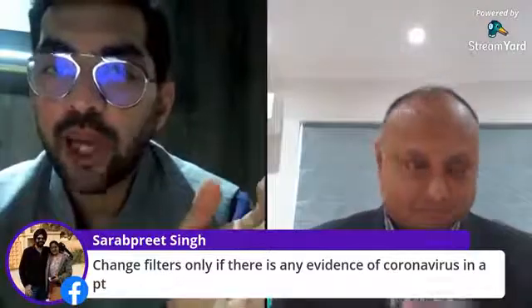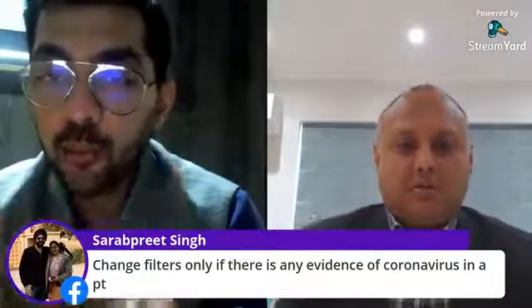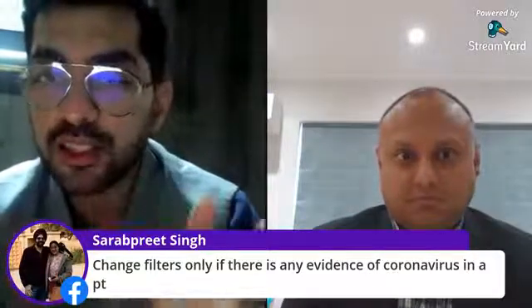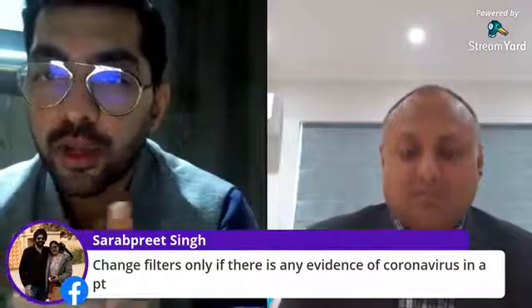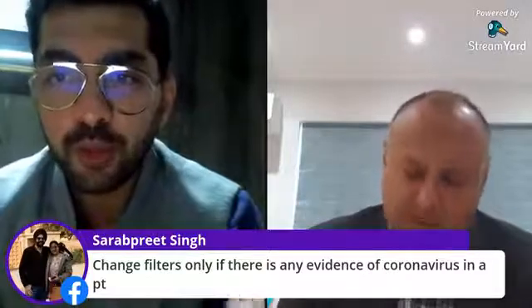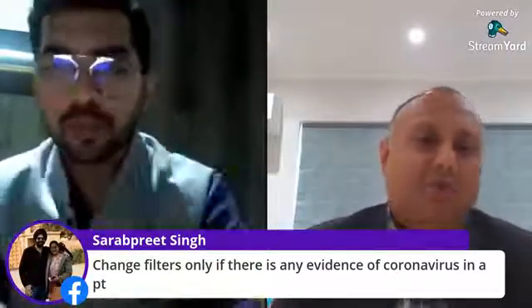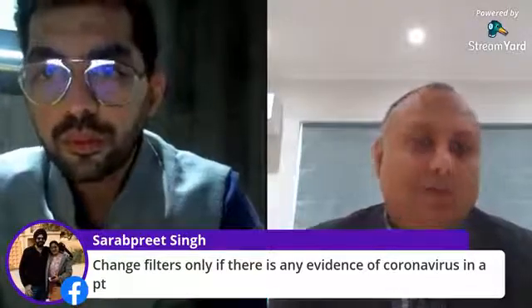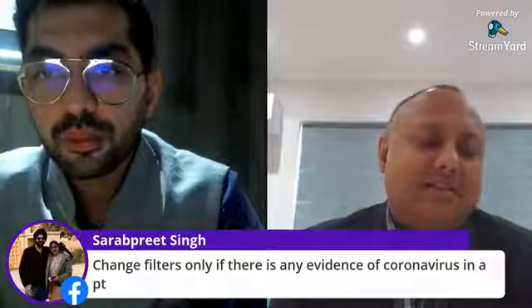I'll go back to a very basic question, Alpesh. How much time before should one actually start doing all of these activities before starting a laboratory? So, basically, it's advised about 2 weeks or something. Should it be more than that? No, I think two weeks is plenty. I think the moment you see your first patient in clinic, or when you start your stimulation, that would be the day that the lab starts doing everything.